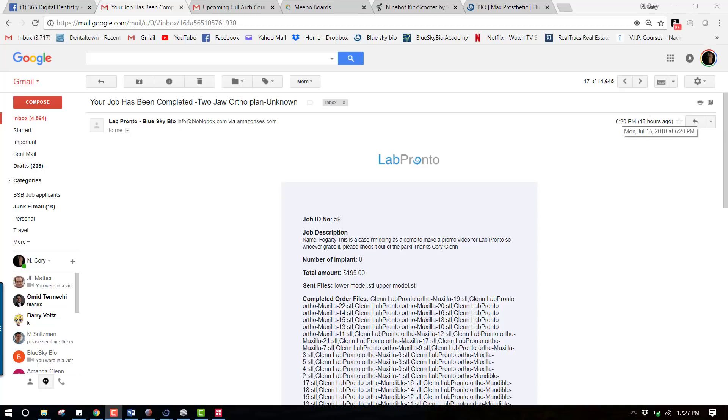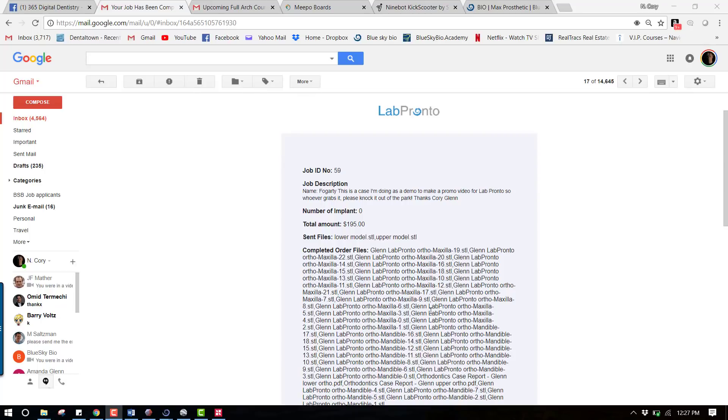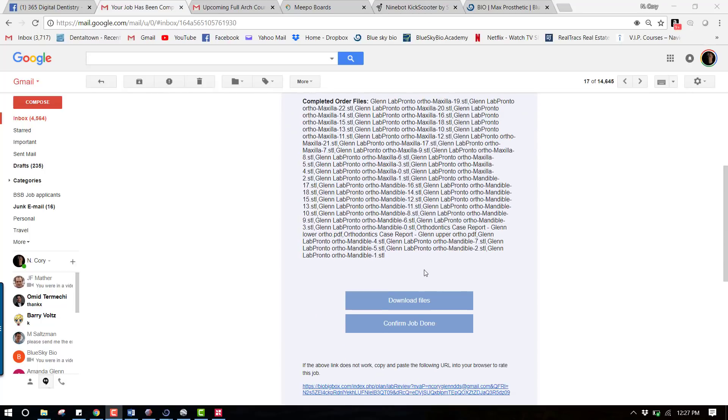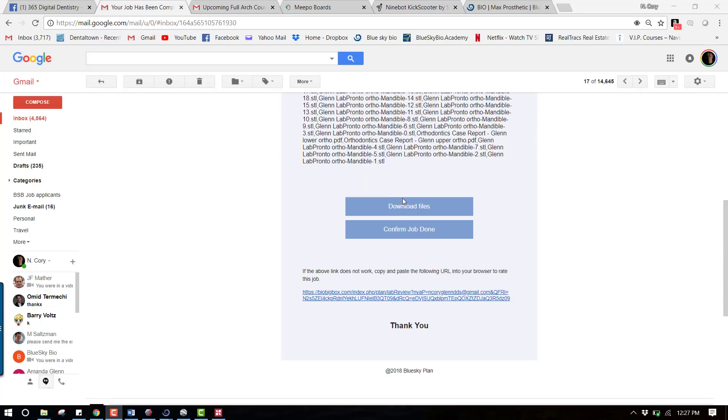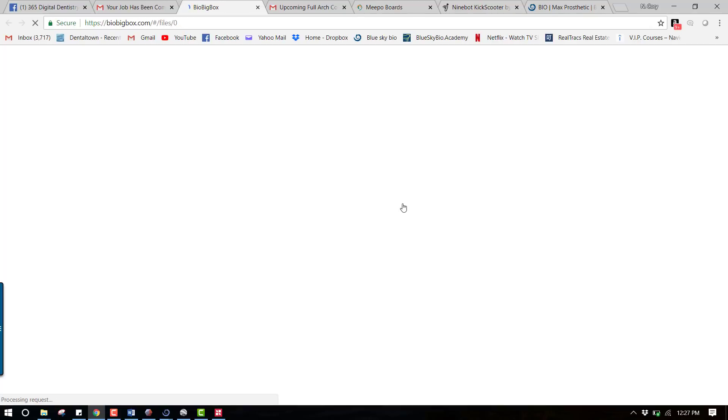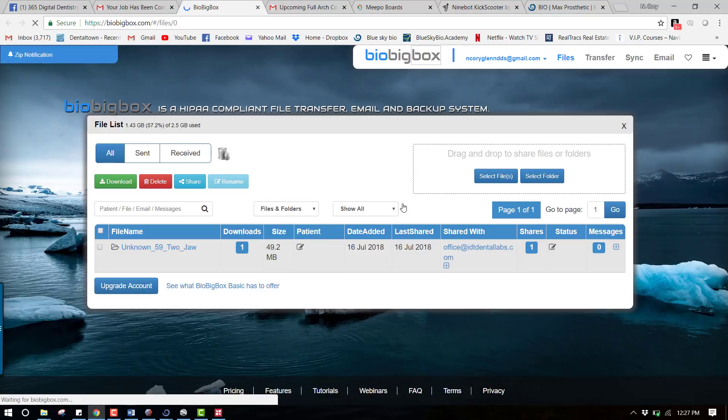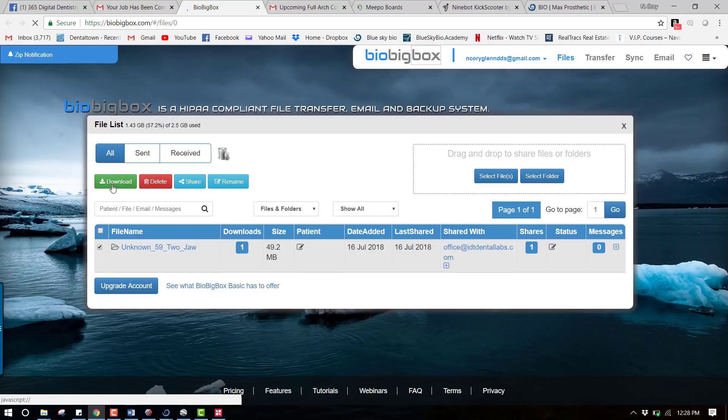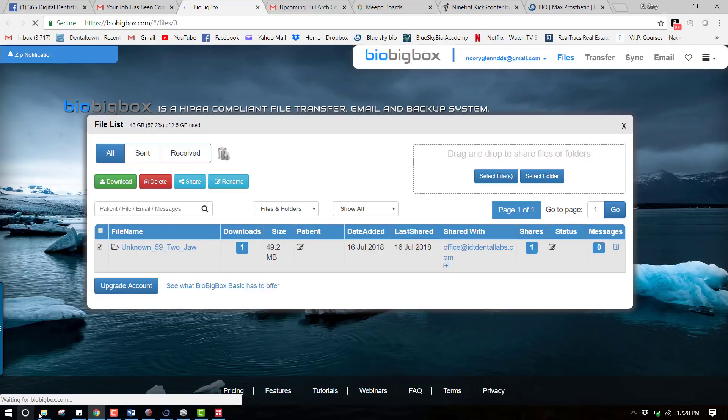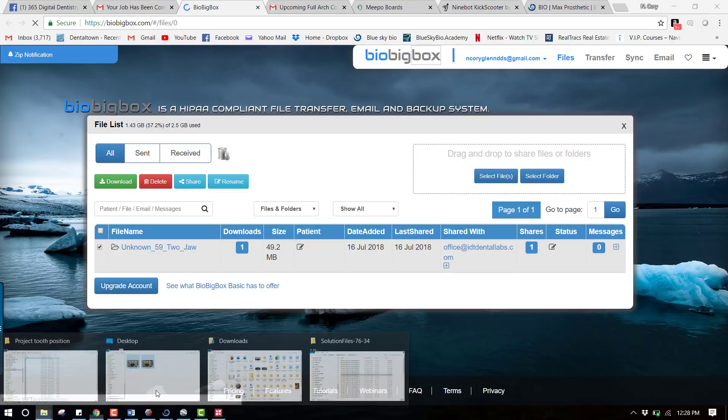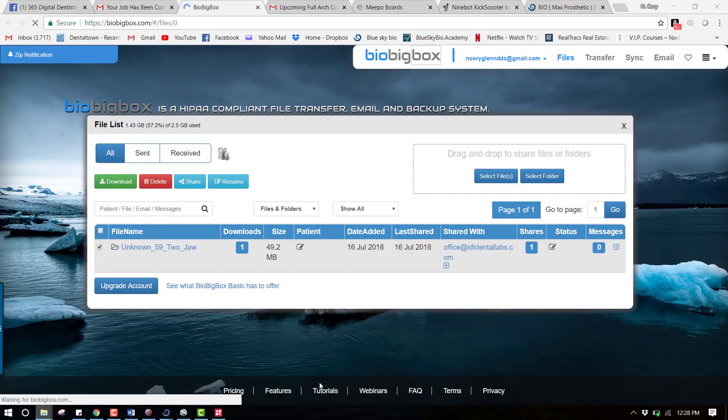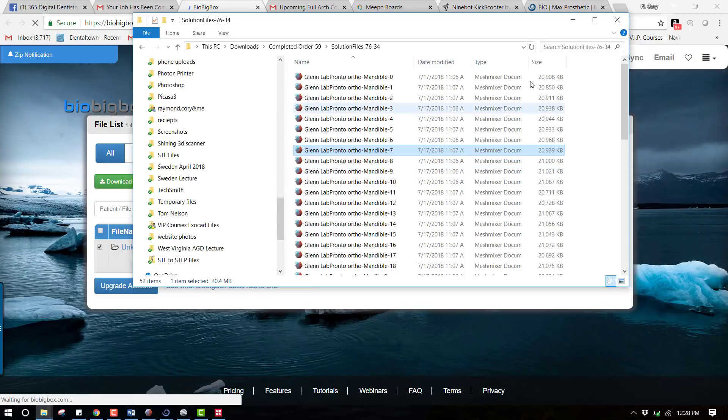If you look at the time when this was completed - 6:20 p.m. - and if you looked back previously at when I submitted it, it was about noon. So it took about six hours or so to get this back and it tells me that the job has been completed. I can go now and download files - when I do that it's going to take me into my Bio Big Box account where I can now download this job. I would simply check that, download it, the software is going to zip it, download it, and now you'll have that on your computer.